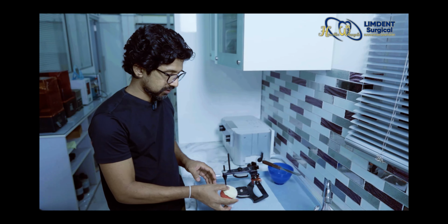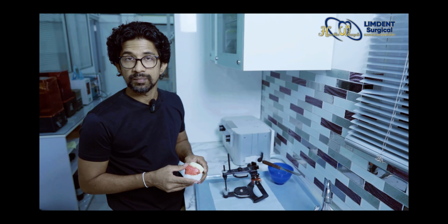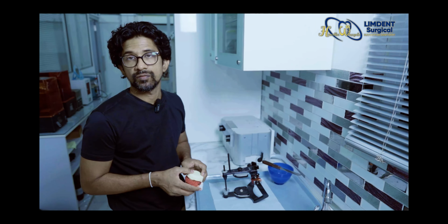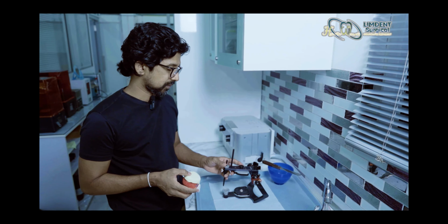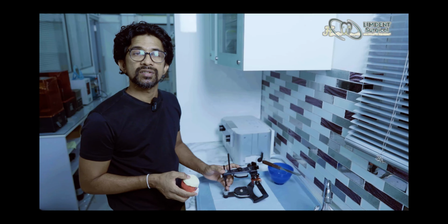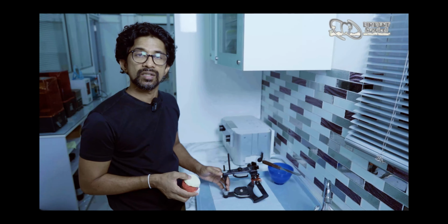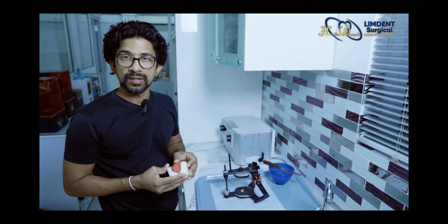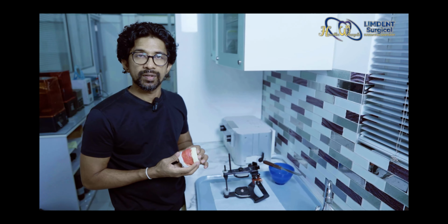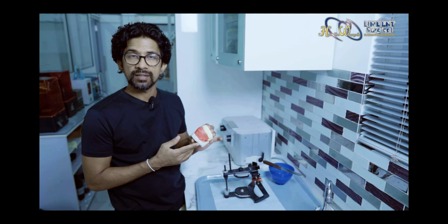Once we get the bite registration, the next step will be pouring the cast and making the final impressions, and then we have to mount that on an articulator until we finish the case, because this articulator will always keep a record of the vertical dimensions. At the same time, we'll be able to do some changes according to the clinician's need, and all the other aesthetic parameters of the patient, what we need and what the patient needs, will be recorded in this bite. So this bite will come as the wax bite as our reference.